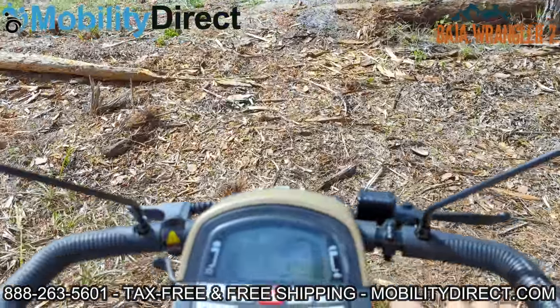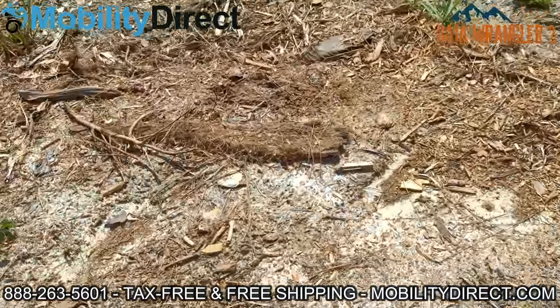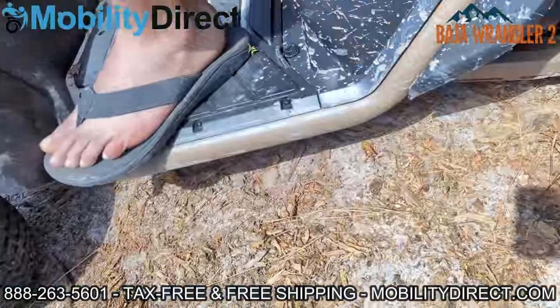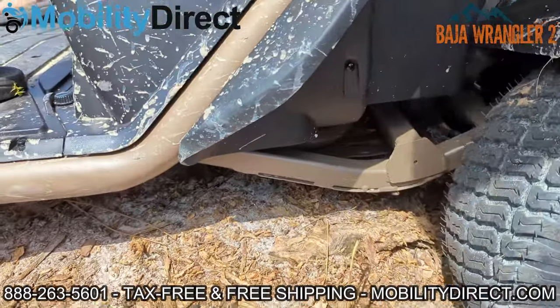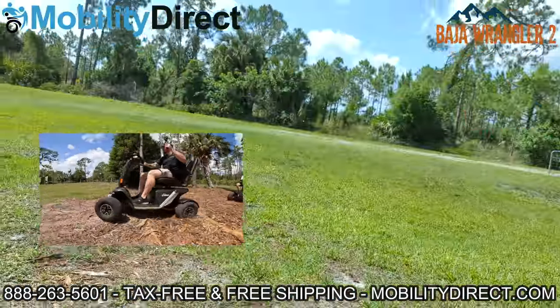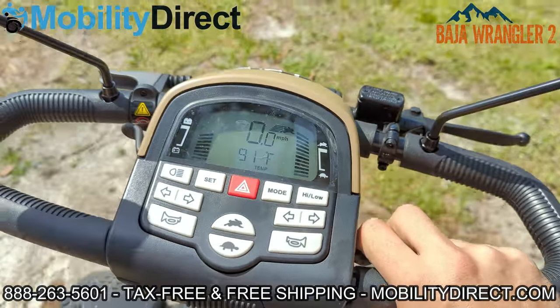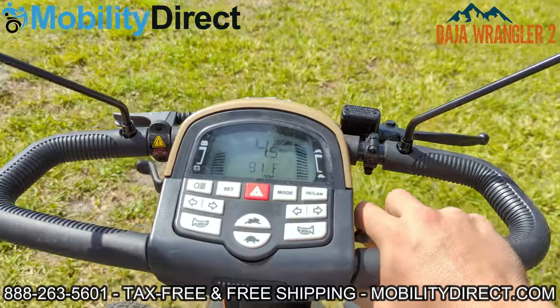We're just going to start driving around — this is probably the roughest part of the property. There's a huge bump here. I'm almost bottoming out. This scooter has about five to five and a half inches of ground clearance. We just went over a huge ramp, and I had no torque or momentum — I was at a dead standstill.